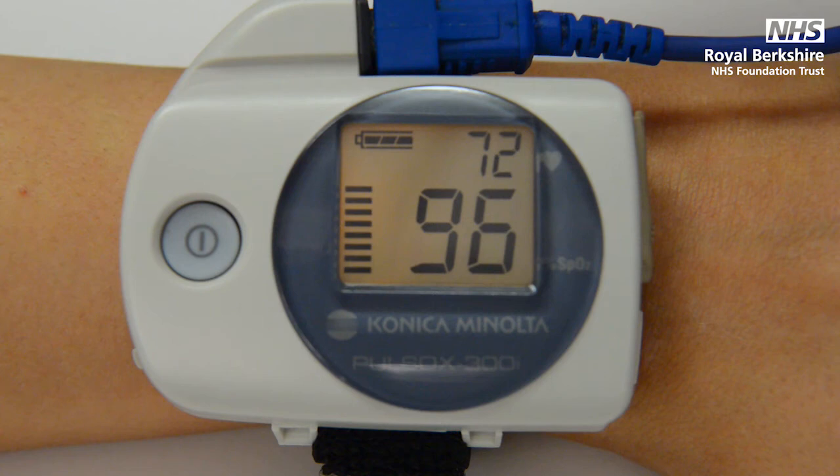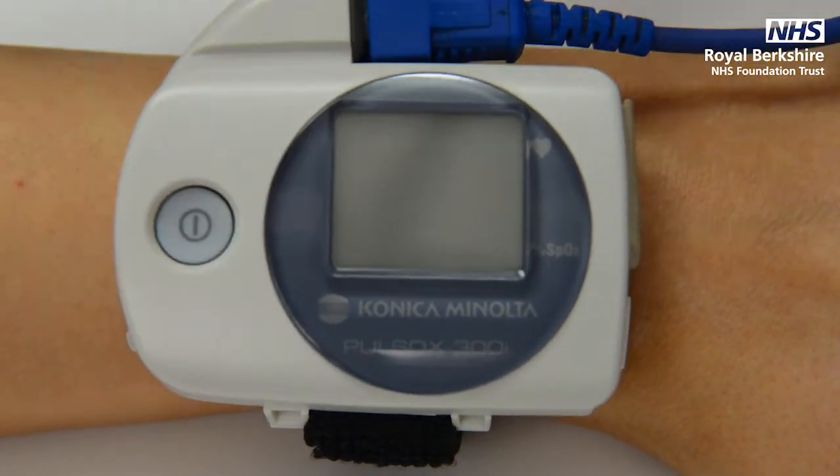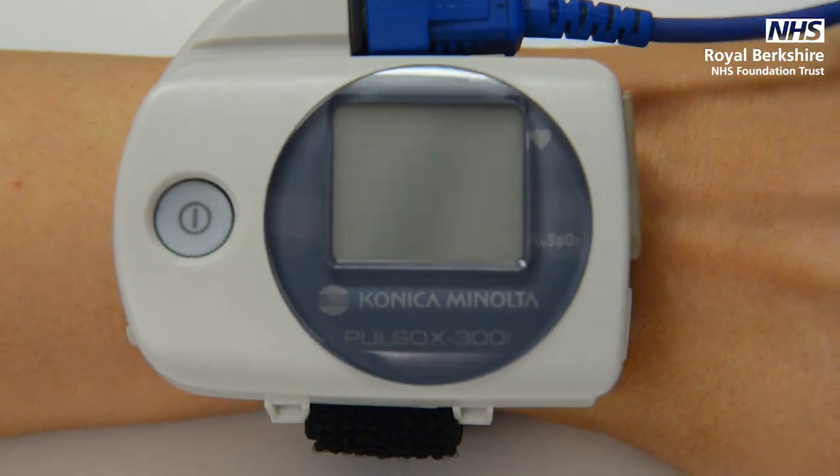Once the two numbers appear on the screen, the device is recording. Leave the probe on the finger all night, as we need to record a minimum of four hours of data. In the morning, turn the machine off by pressing and holding the power button, and then place back in the blue case.